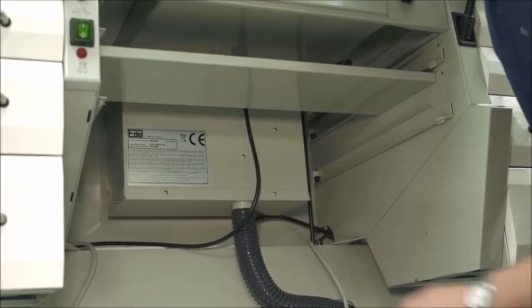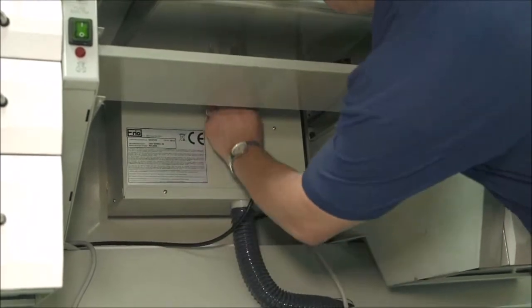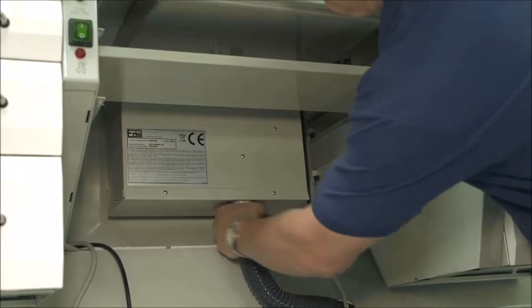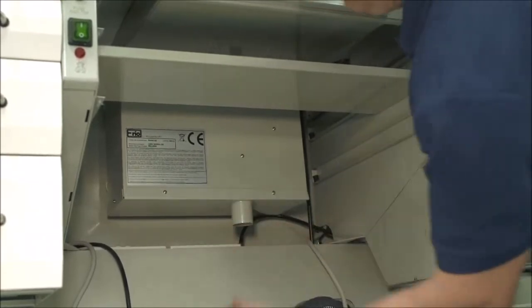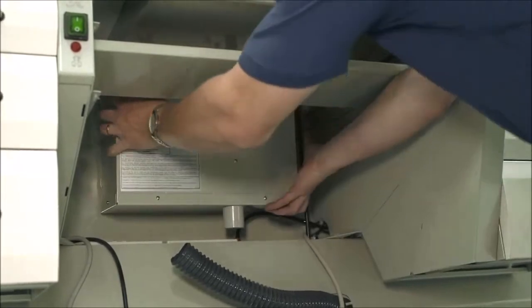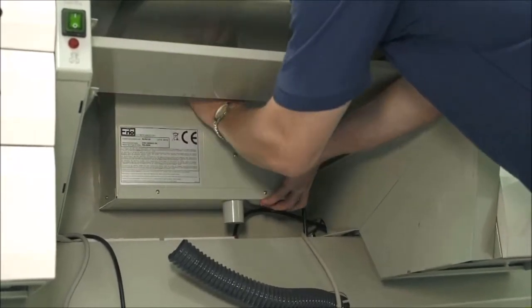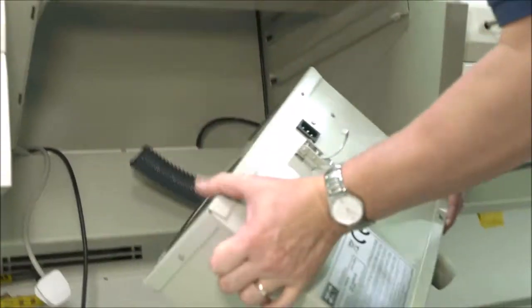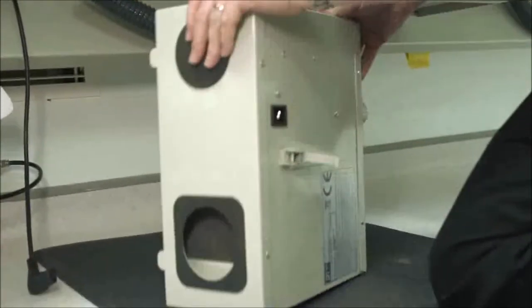To replace the motor box, firstly isolate the power, remove the power supply, pull forward and release the exhaust. Undo the catch at the top, bring the motor box forward, and remove. Bearing in mind it weighs approximately 8 kilograms so it's quite heavy.